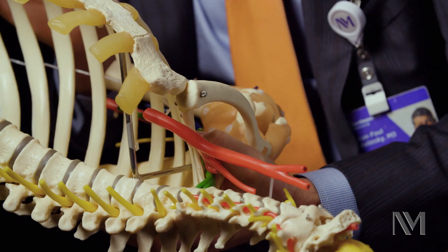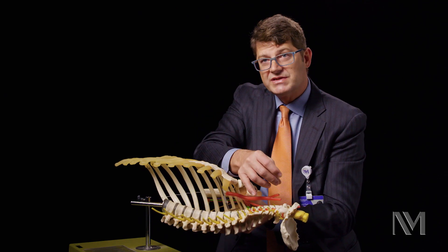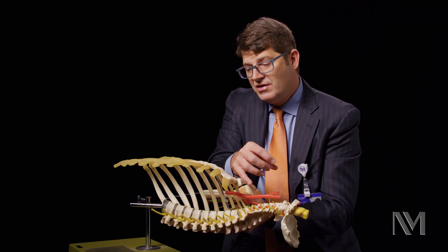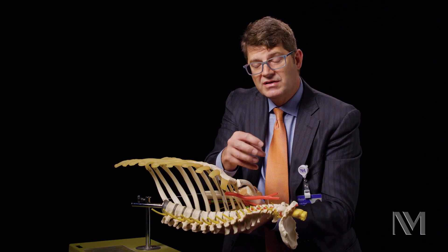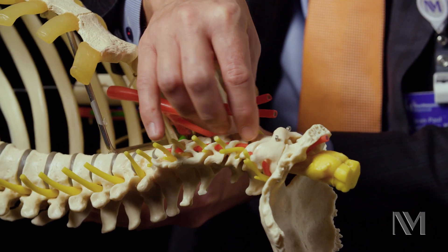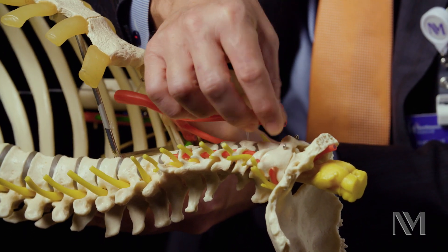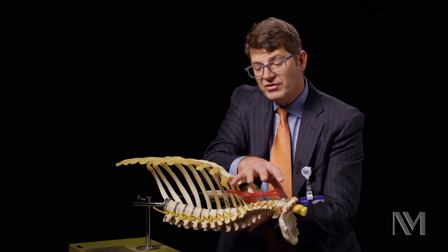Operating like this would be super uncomfortable, so we bring in an endoscope as well. The endoscope allows us to have a beautiful visualization of that area. We're looking up through that endoscope at C2, and then we bring a drill — or in this case, a bone ultrasonic device — to remove the bone from C2 up along the anterior aspect of C2, behind the C1 arch, up to the odontoid, and then drilling that down from the top until all that bone has been removed. And that's the ventral approach.